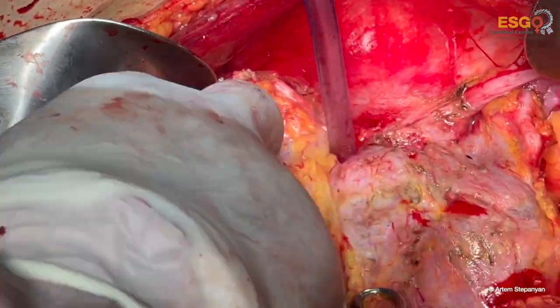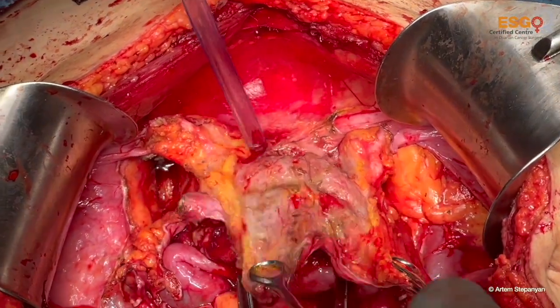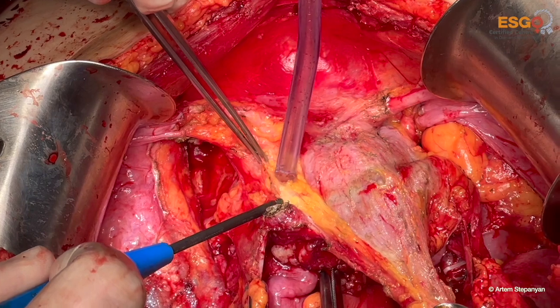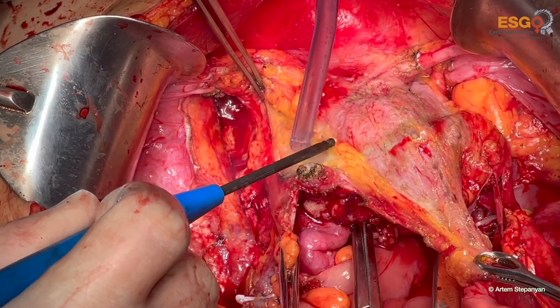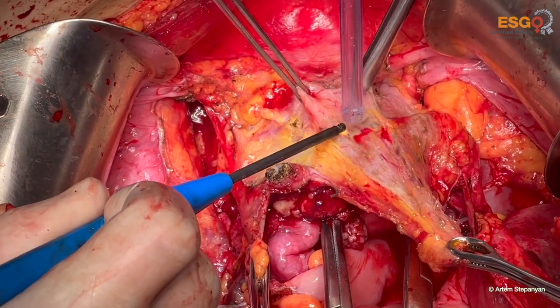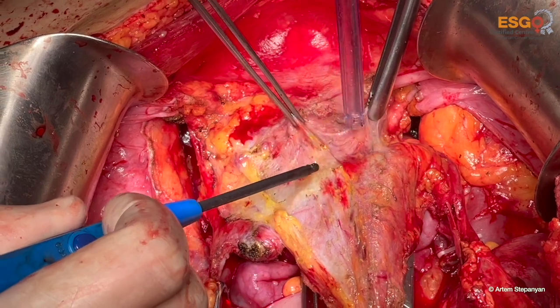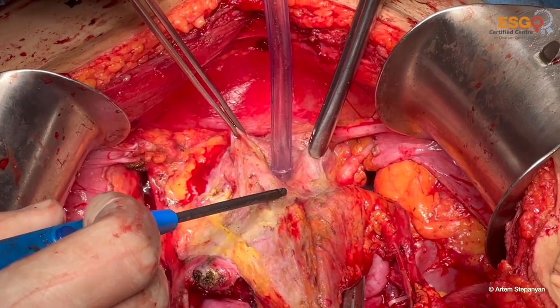and gradually strip the peritoneum from the bladder. Our goal is to achieve the anterior vaginal fornix. This is why we deperitonealize the bladder, and once we reach the bladder dome, then we detach the bladder from the uterus down to the anterior fornix.